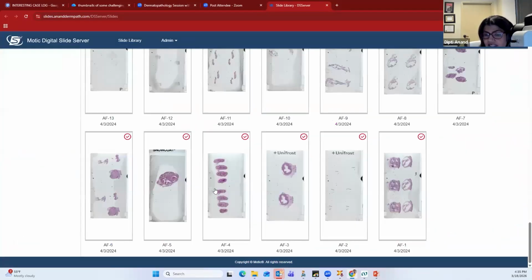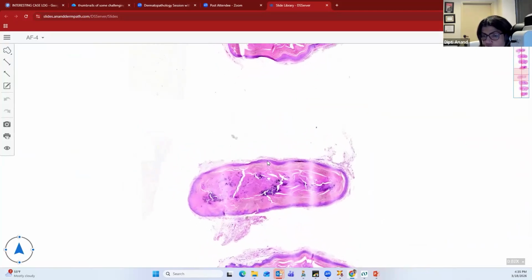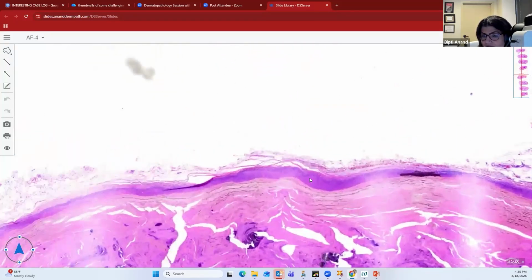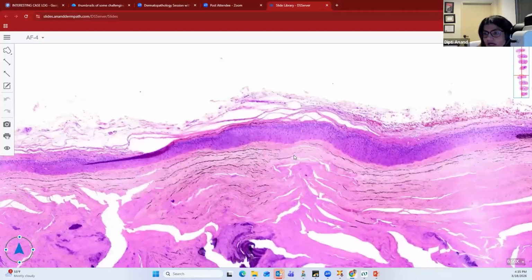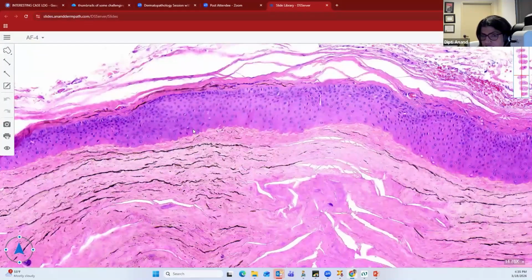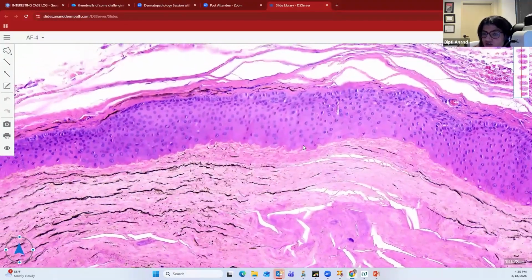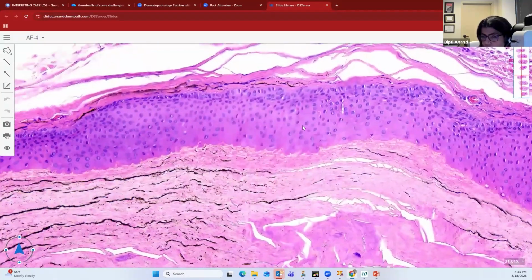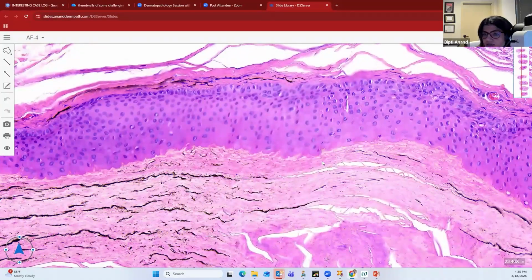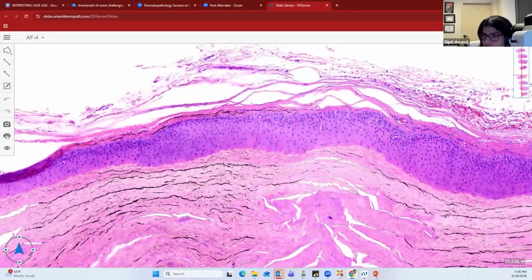The next pattern of keratinization is your trichilemmal keratinization, which is what you see in a pilar or trichilemmal cyst. So trichilemmal keratinization is derived from the isthmus part of the hair follicle. And here you see keratinization through the absence of a granular cell layer. So you do not see a granular cell layer. It's pretty abrupt keratinization. And the trichilemmal cells are going to have lots of pink eosinophilic cytoplasm, and they're often pale appearing. But you can see that there is keratinization and no granular cell layer. So that's what you see in a pilar cyst or a trichilemmal cyst.